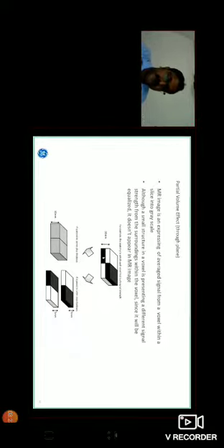So if you scan in 10 mm, it will be like this. But if you scan in 5 mm slice thickness, you can easily distinguish these two structures or these two signals separately. So that means increasing the slice thickness, the more partial volume effect. Reducing the slice thickness, partial volume will be less. Simple.